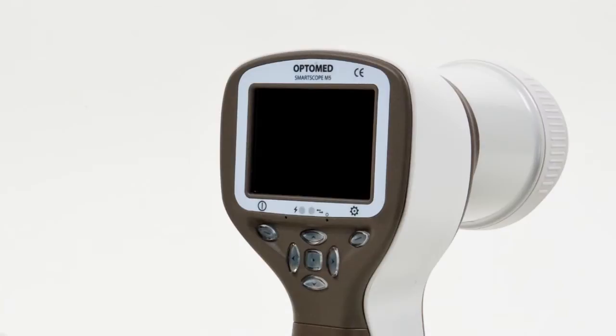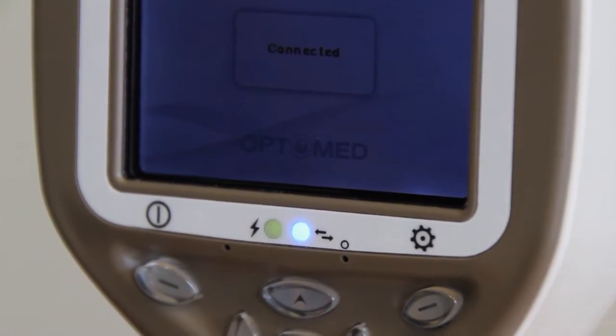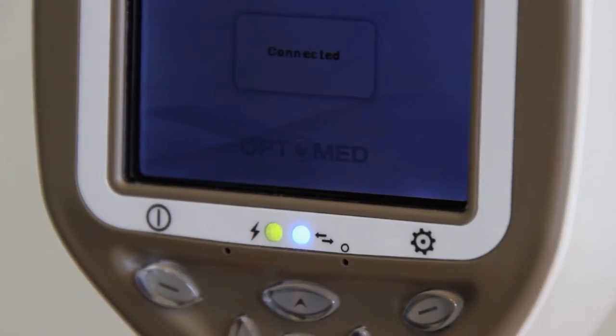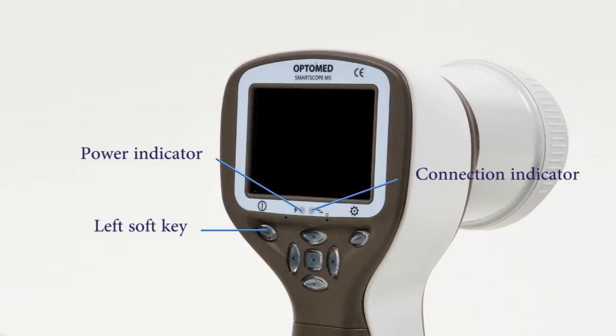Let's go through the buttons and features of the device. The left soft key is used for powering the device on and off — power off by pressing and holding the button. There are two LED indicators. The left LED indicator shows green when the device is on, and a flashing green light indicates charging when the device is in the cradle and the USB cable is connected to a computer.